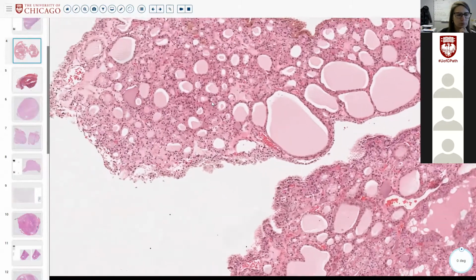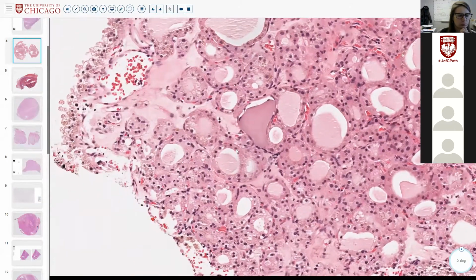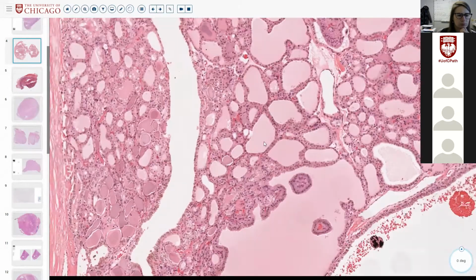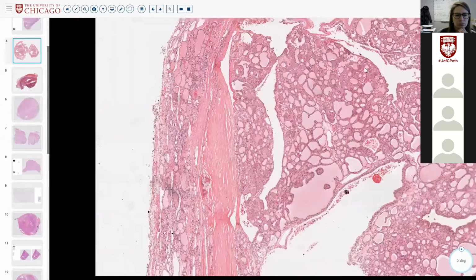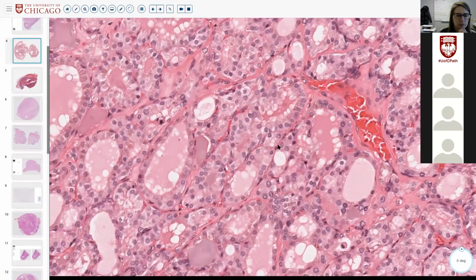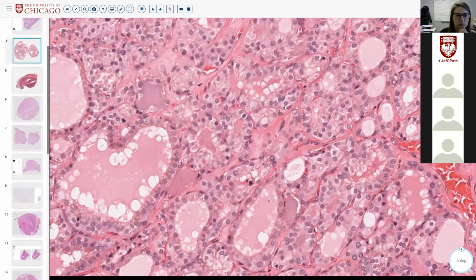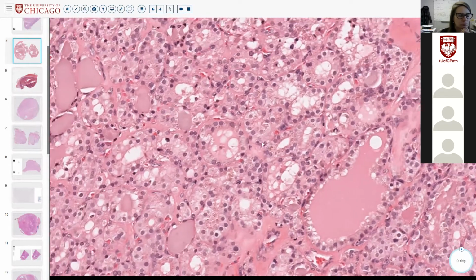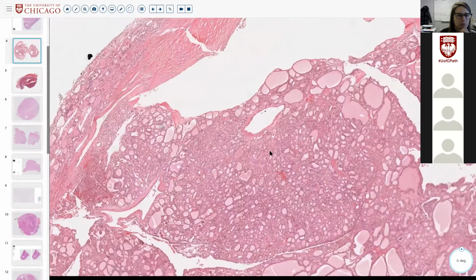areas. And so if we look maybe more closely into the more quasi hypercellular areas, just because maybe there's more microfollicular nodules. Let's see here, what's going on. I also did not preview these, but in terms of nuclei, they look pretty uniform. I'm not seeing the same grooves or atypia from the PTC nuclei that we were observing earlier. So, there's a little bit of scalloping here.